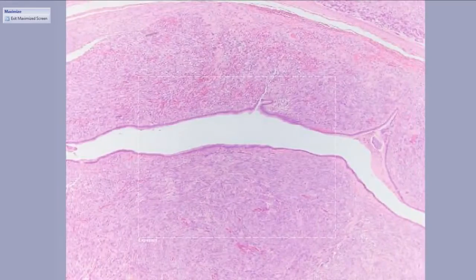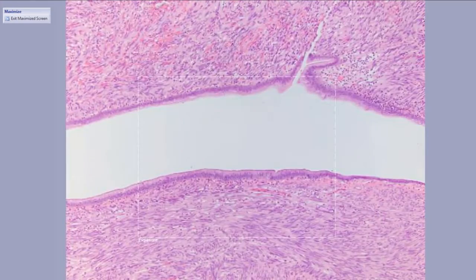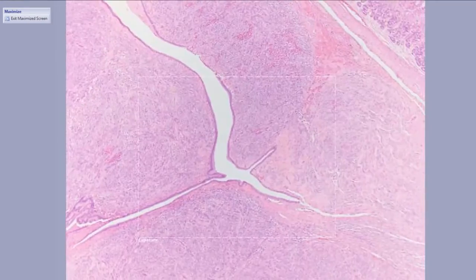This example is a little unusual. It's kind of fun. It's got these entrapped glands, maybe a little bit of gastritis cystica profunda or something. This is not something you see commonly, but I think it looks kind of neat. Has no bearing on the outcome of the lesion.